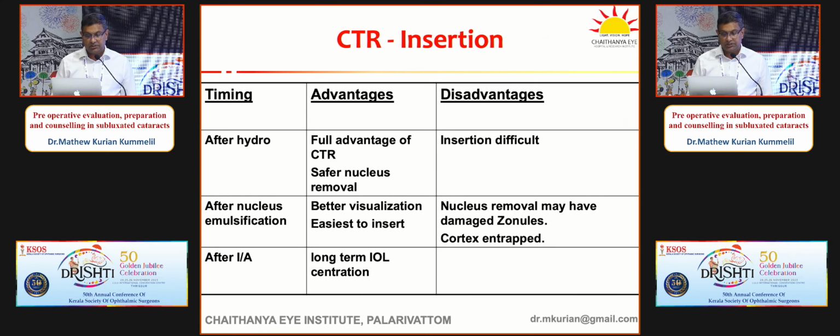When to insert the CTR? After hydro, full advantage of CTR is there. Safer removal of nucleus, but insertion may be difficult. And if at that time the zonulopathy progresses and you lose the lens bag complex into the vitreous, then it is much more of a challenge. After nucleus emulsification, better visualization, easier to insert, but then you may end up with a cortex entrapped in that.